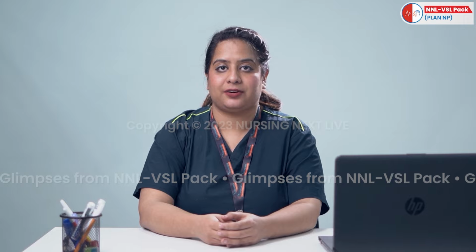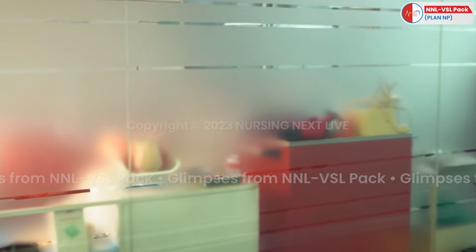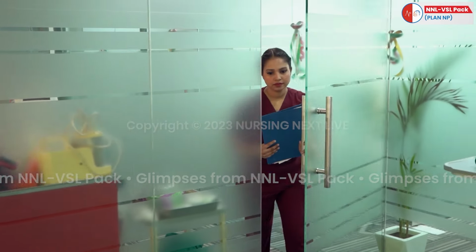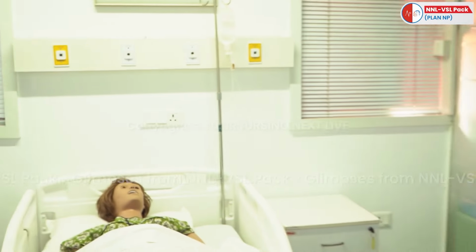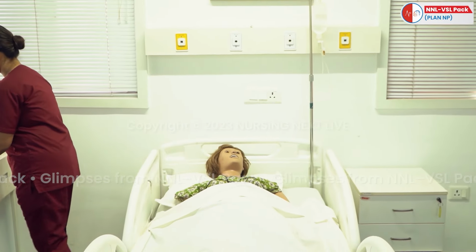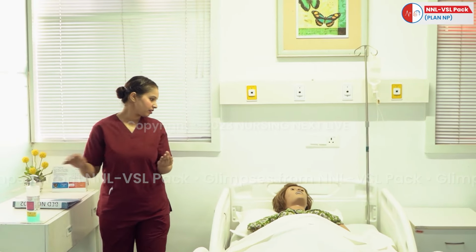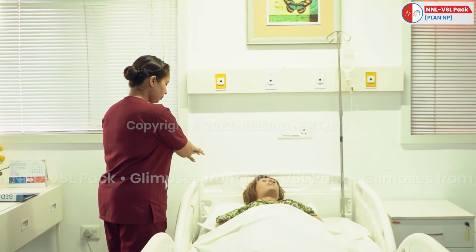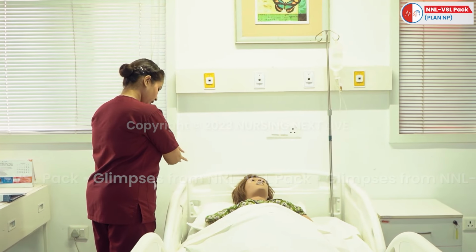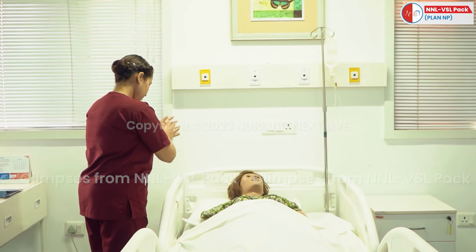Let's see the steps of procedure of female catheter care. Enter the patient room. Introduce yourself to the patient. Check the patient's identification. Good morning, ma'am. This is Shilpa, your assigned staff from 8 AM to 2 PM. Ma'am, may I know your name? Okay. Ma'am, can I check your ID band? Just give me a moment.